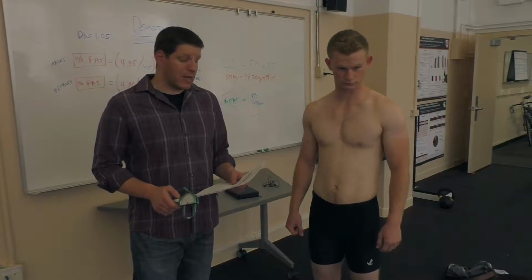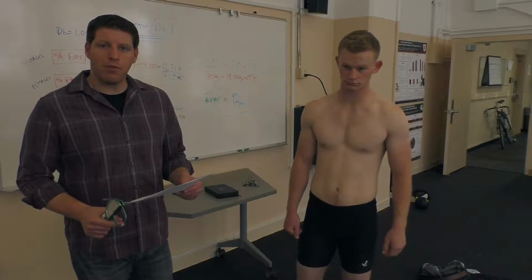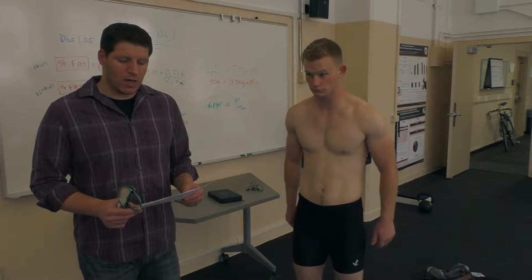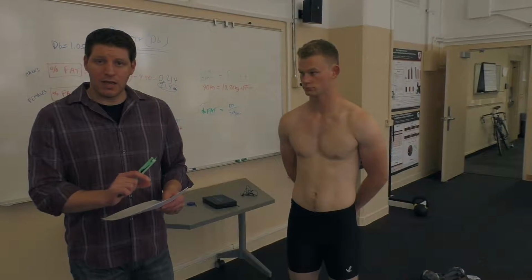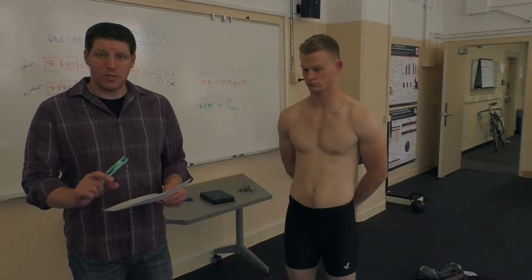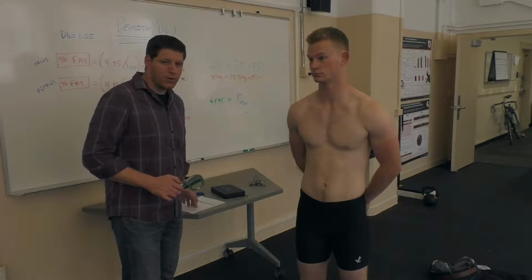Our participant for today, as seen here, is 19 years old. He weighs 75.5 kilograms, and he's 180.3 centimeters tall. And that data is at the top of your data sheet, so you need to make sure to record that, okay? So now we're going to run through the skin fold technique.